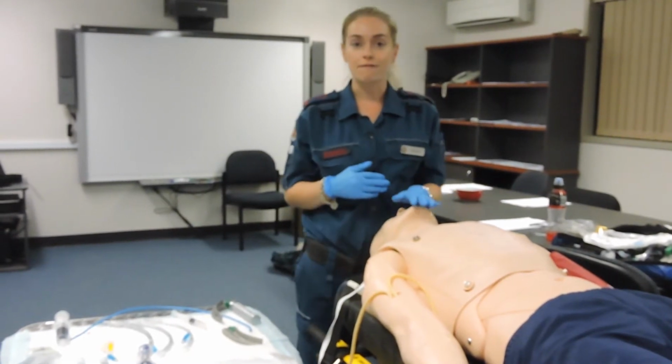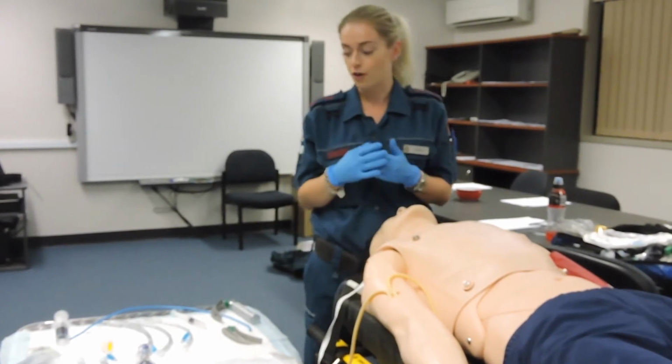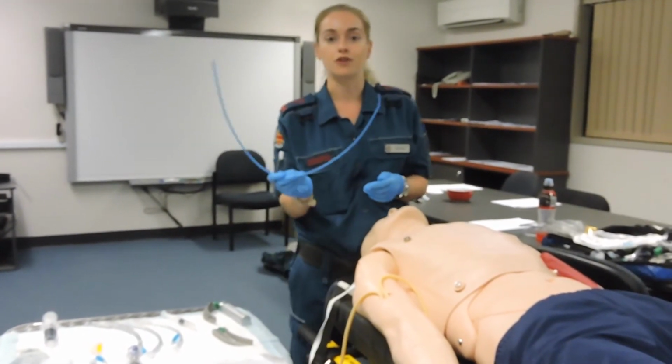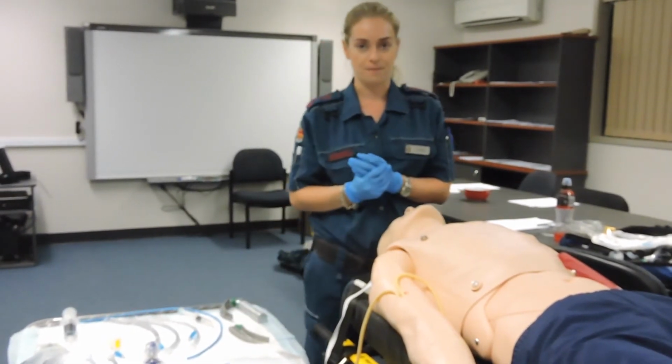After we've had our first attempt at intubation, the most important thing to realise is that in QAS we have lots of little structured guidelines. For example, in QAS we always use a bougie to increase our chance of a first pass intubation, whereas in other services you don't have to use that first go. We always make sure we brief our team.